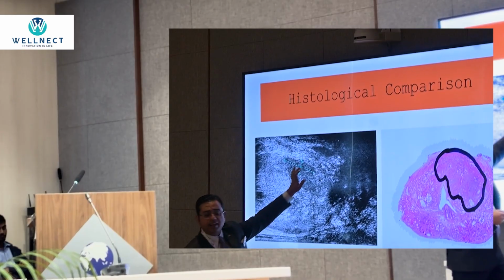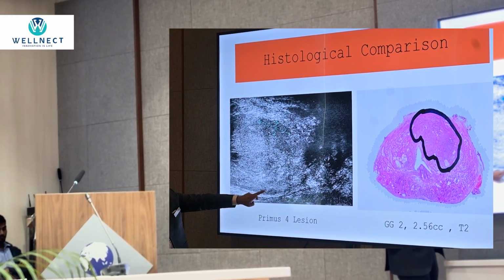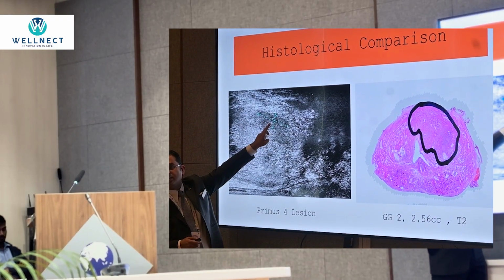So it is basically in the gray zone, PSA gray zone or extended gray zone, say 4 to 15 or 4 to 20. This is the area where we are trying to find out how to cover. So this is an anterior lesion. This is an anterior lesion. Again, sir, this is the normal zonal anatomy, and in preference to this, it is dark and the zonal patterns are distorted.